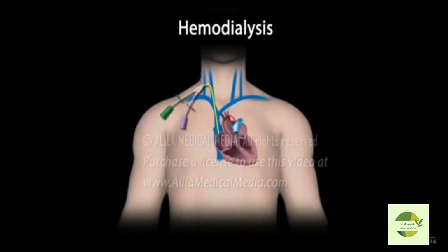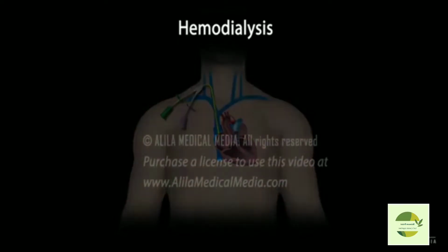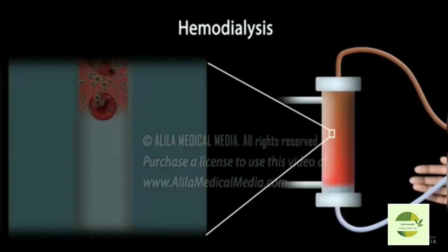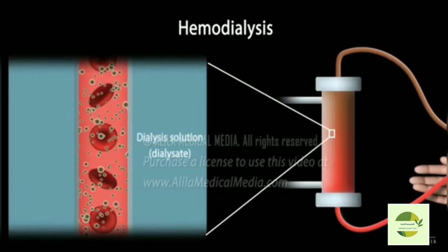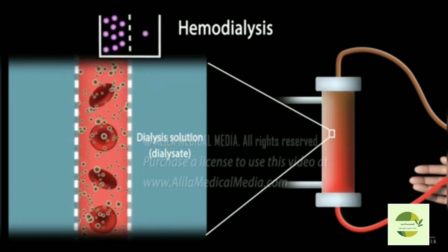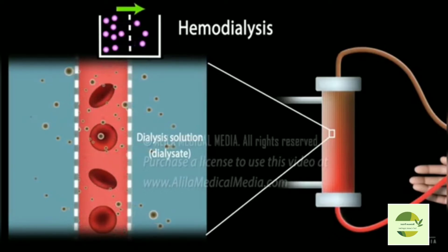When the solution is hypertonic, glucose will move to blood, causing hyperglycemia, and when we use a hypotonic solution, glucose will move from blood to dialyzer, causing hypoglycemia. Only small molecules like water, nitrogenous waste, and electrolytes can pass through the tube walls, which operate as semi-permeable membranes. Water and solutes migrate from higher to lower concentrations during filtering via osmosis and diffusion.